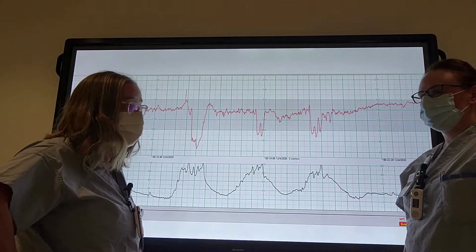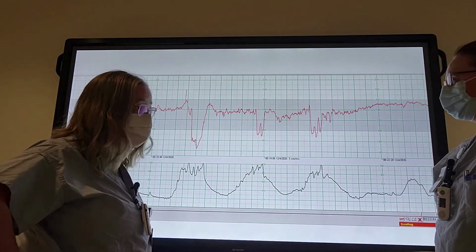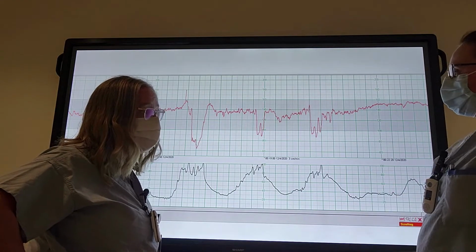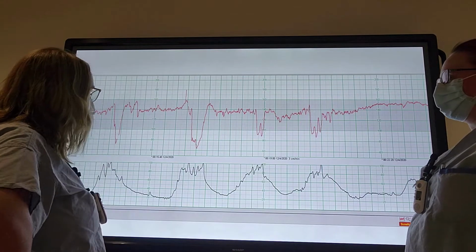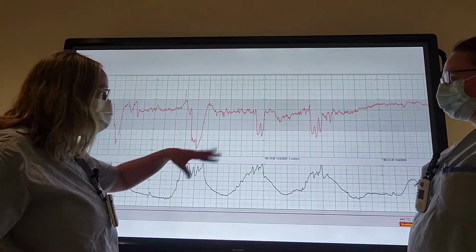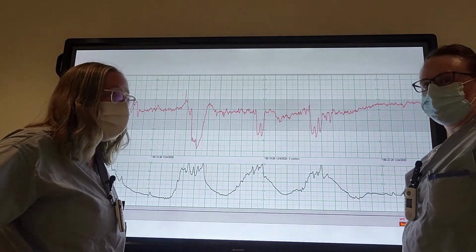I think they're okay. I think my patient's just having some earlies. Okay. So I'm looking at your tracing here, and you think that these are earlies? Why do you think that they're earlies? Well, they're just coming with the contraction, so it just must be head compression.